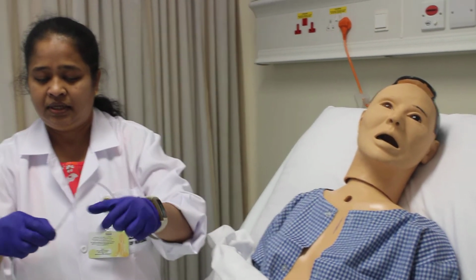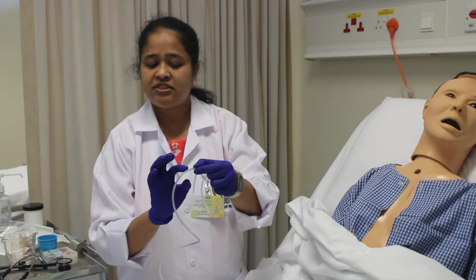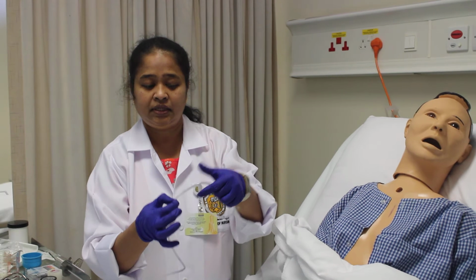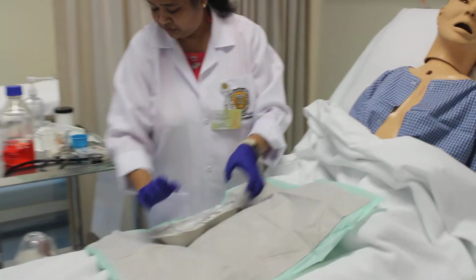After I measure, let me mark it. This is 45 centimeters, so just add 5 centimeters to it. So how much am I going to insert inside? I will be inserting 50 centimeters of this tube. Okay. Keep it with you.